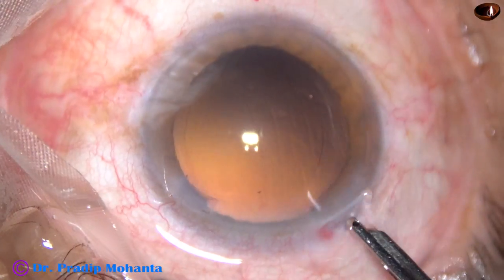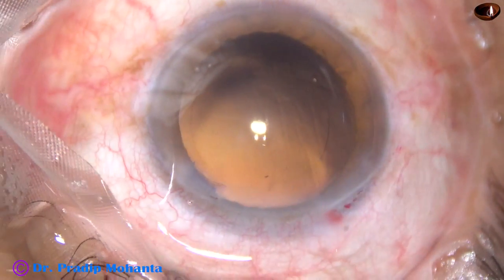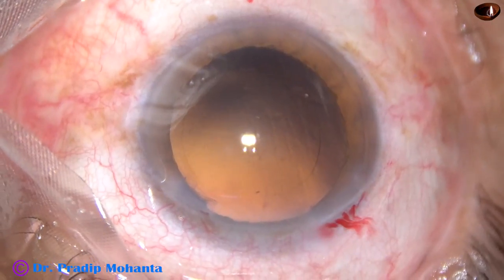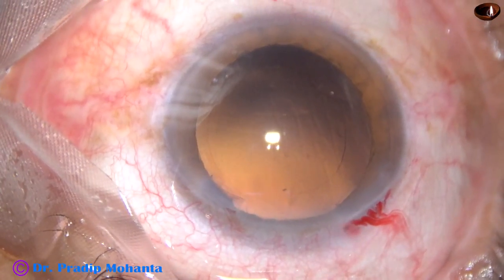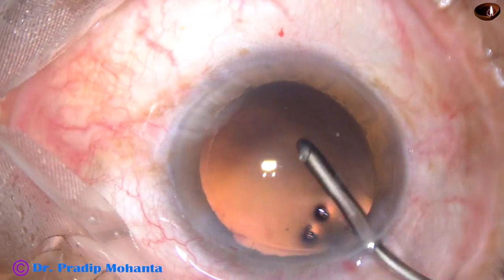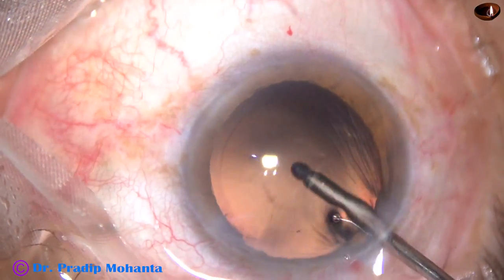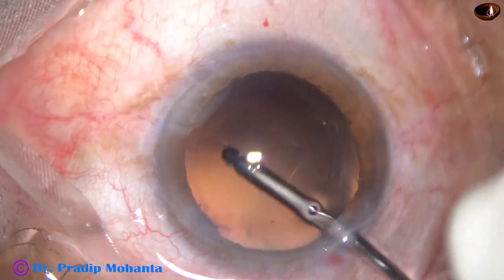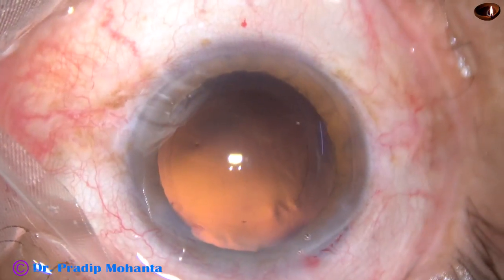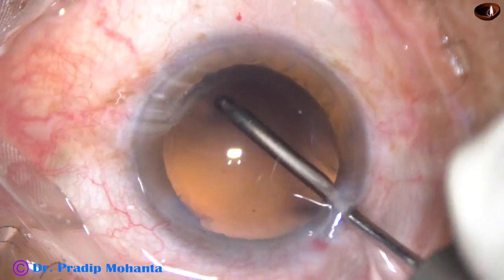And now this is hydro polish. Hydro polish means the irrigating fluid is directed towards the posterior capsule. Whatever lens epithelial cells are sticking to the posterior capsule get dislodged, and the posterior capsule gets nicely polished.